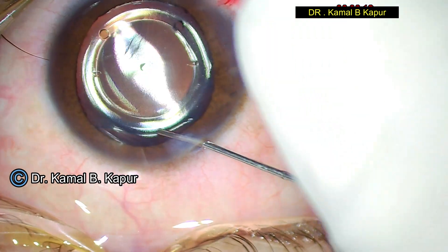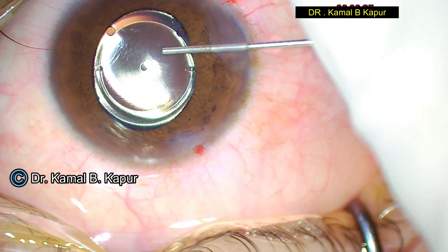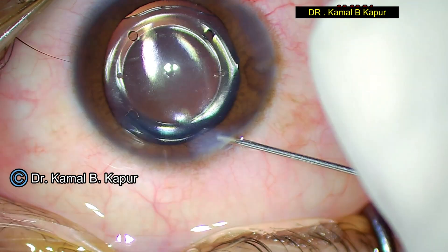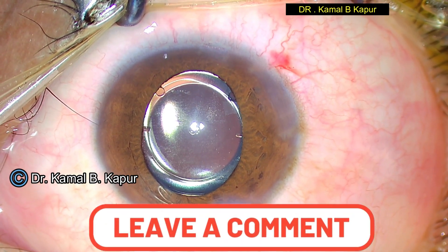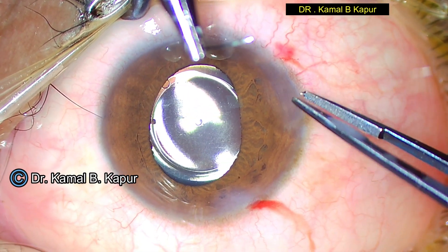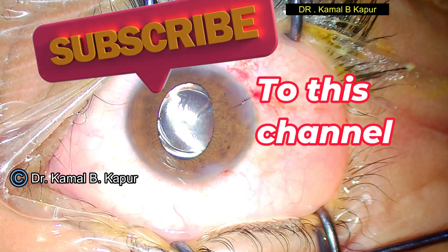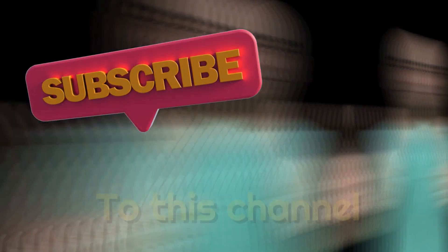We hydrate the main wound and the side port, confirm correct orientation of the phakic lens in the toric axis, and put a slight amount of miotic into the anterior chamber. Once the toric alignment correction is confirmed and the pupil starts closing down, we close the enlarged wound with one single suture, embed the knot, cut the suture, and the patient is back to normal.